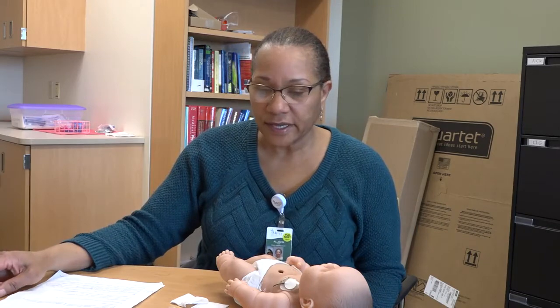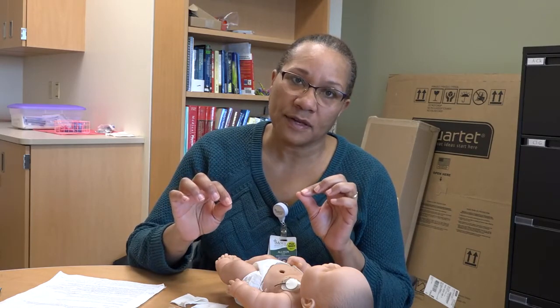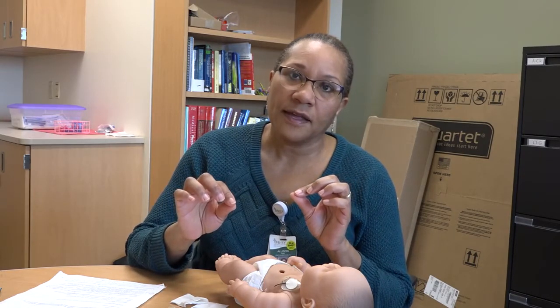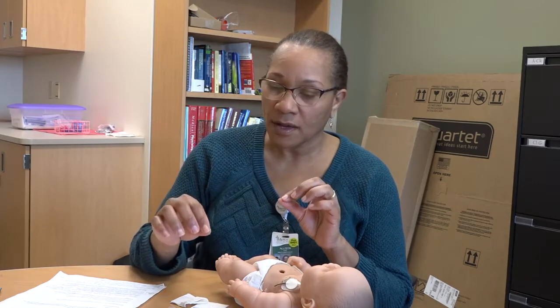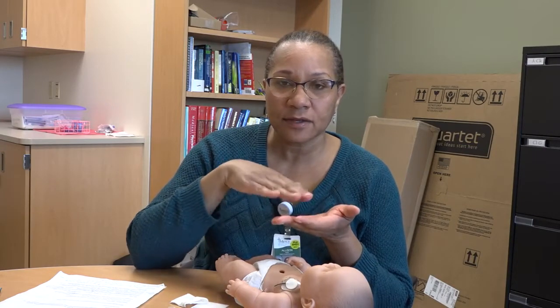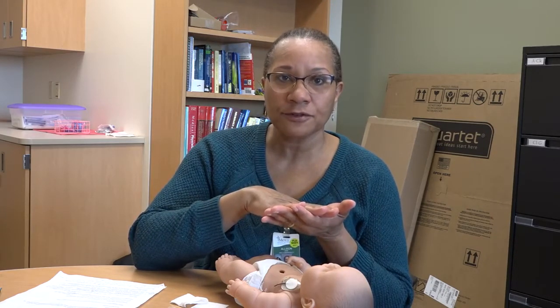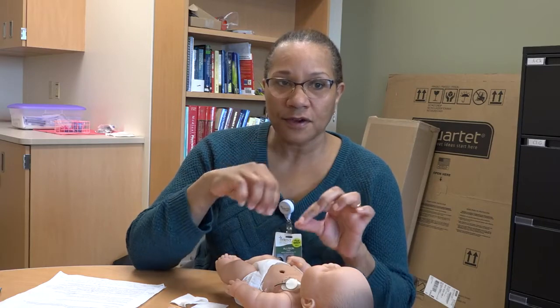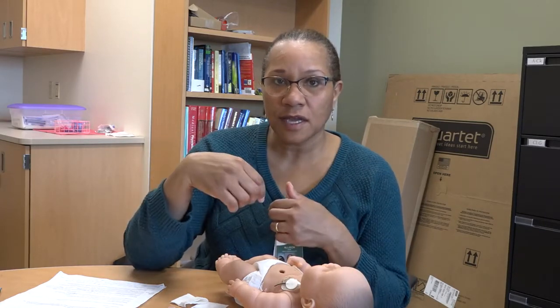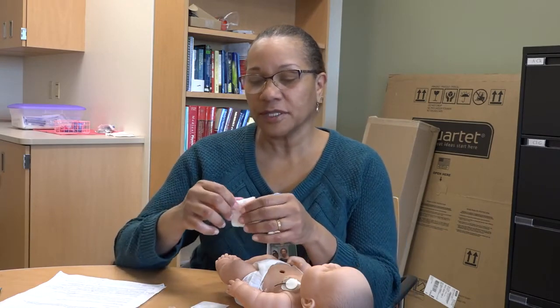Now we're going to talk about skin care. After the baby initially comes back from surgery, there's going to be a thick duoderm dressing around the G-tube site, and a piece of gauze with a clear tegaderm covering over the umbilicus, over the belly button. That dressing will stay in place for 48 hours after the surgery. Then they will take that thicker duoderm dressing off and also take off the tegaderm and the gauze, and it will be replaced with a split 2x2.